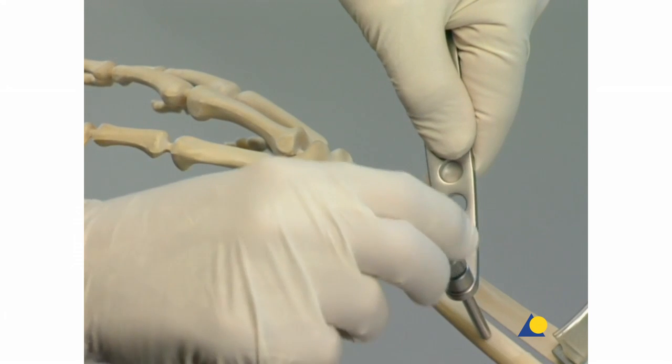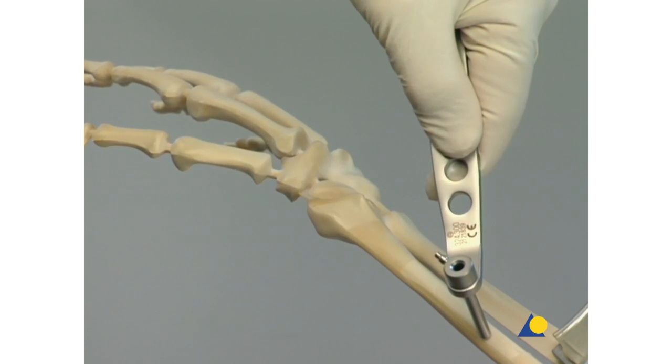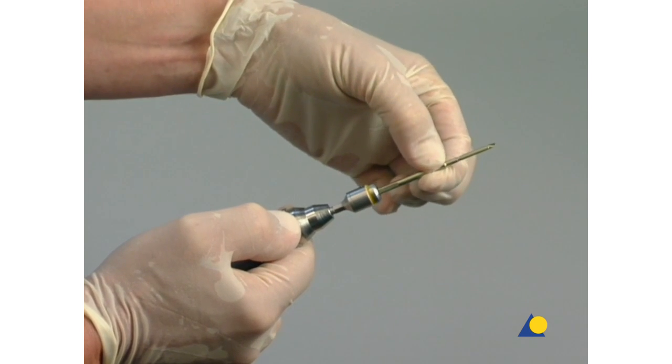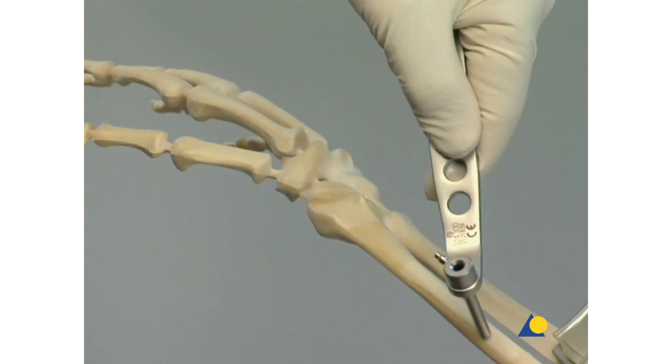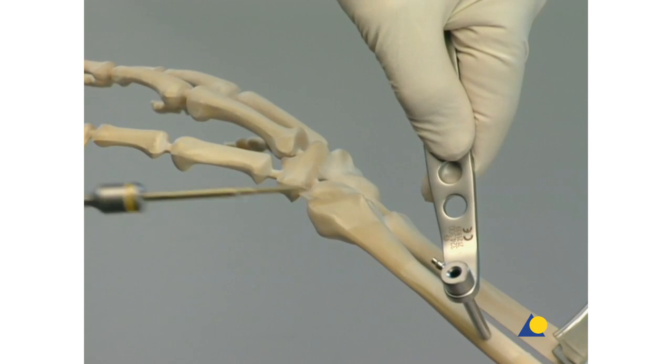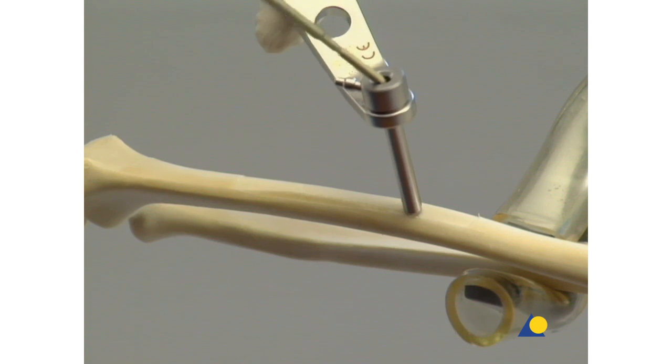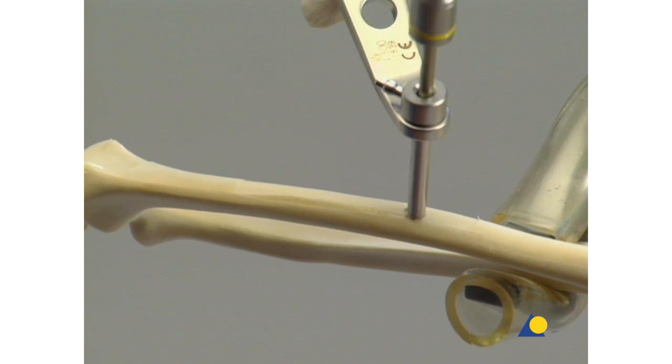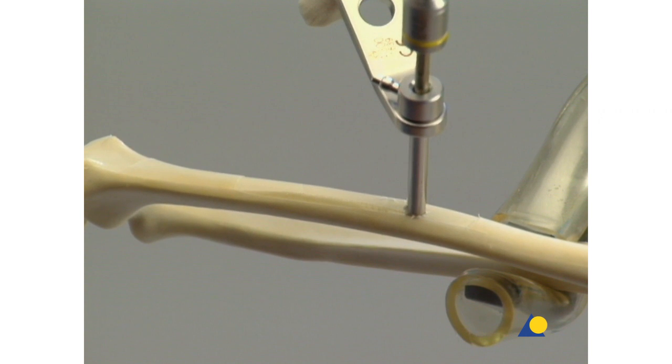The trocar and drill sleeve are removed. The self-drilling Schanz screw is inserted into the adapter. The power drive is used to advance the Schanz screw through the threaded drill sleeve until the tip is anchored in the far cortex. In the clinical situation, irrigation is recommended while inserting the Schanz screws.